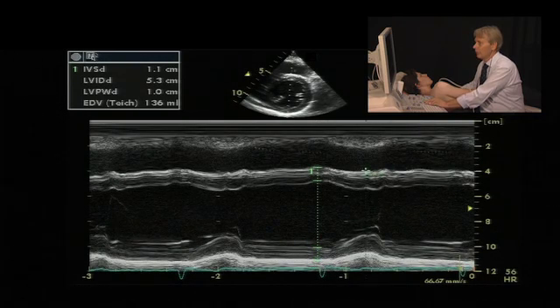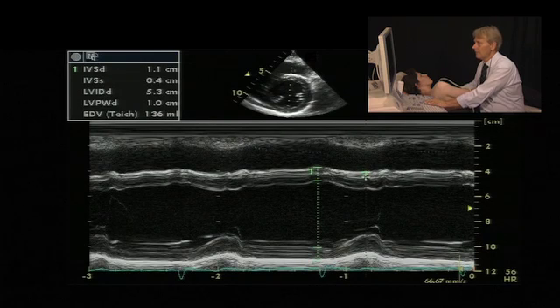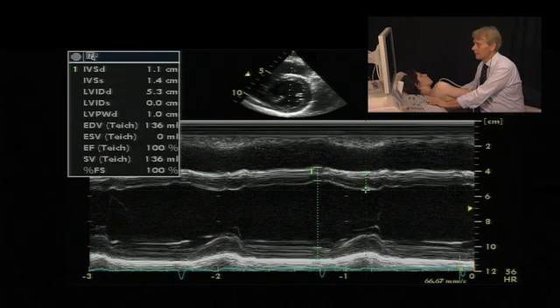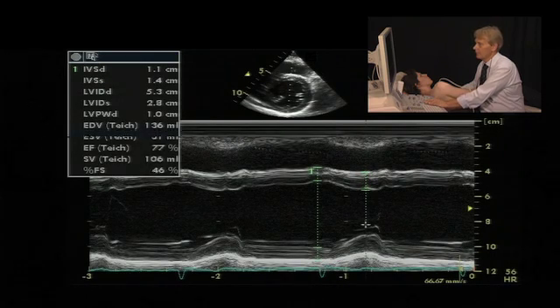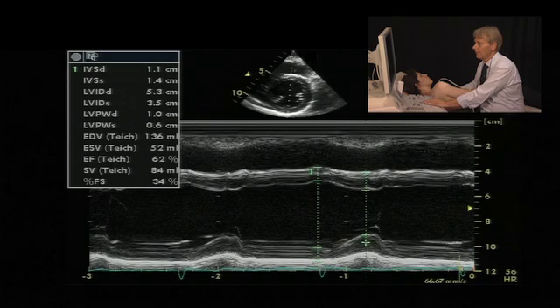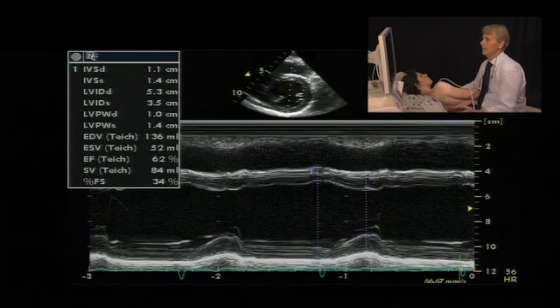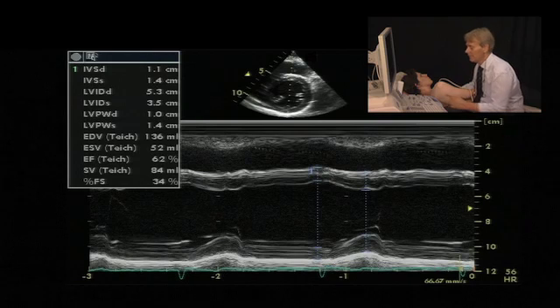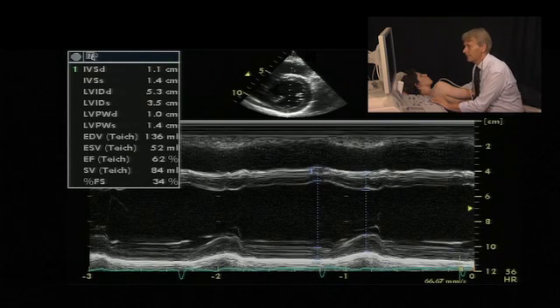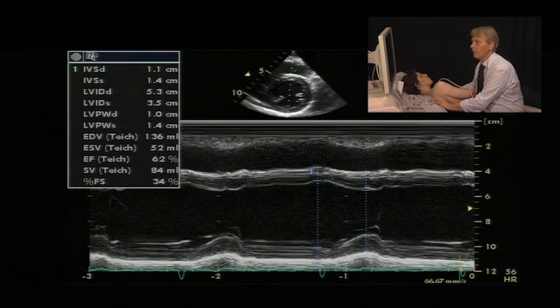You would then perform the same measurements at systole: for the end-systolic diameter and for the posterolateral wall. These are essentially the measurements that you would perform.